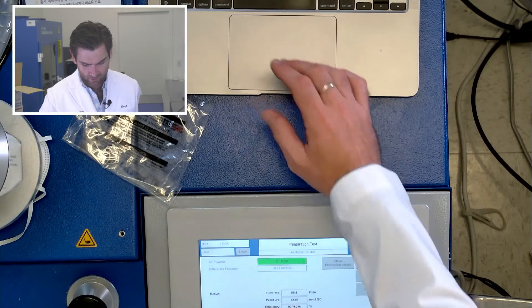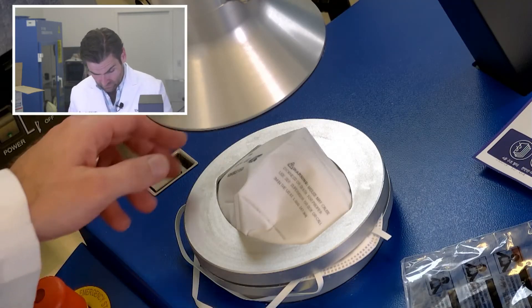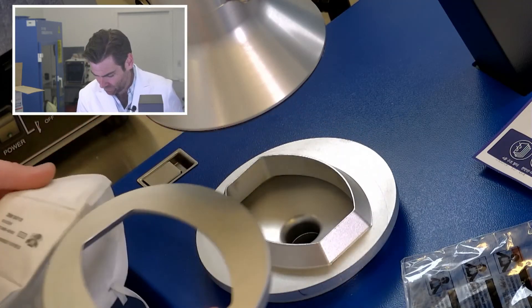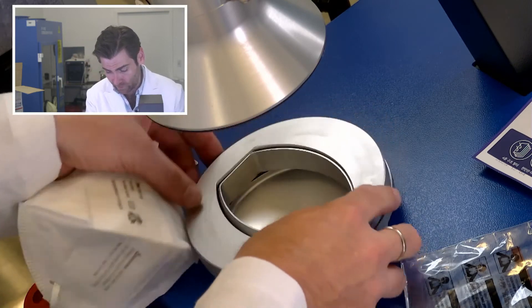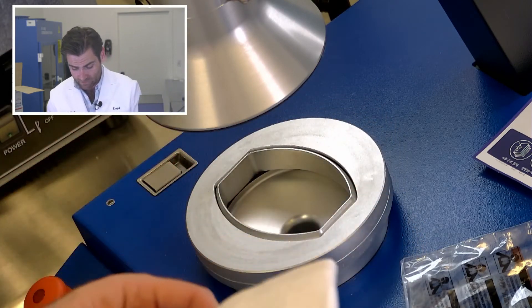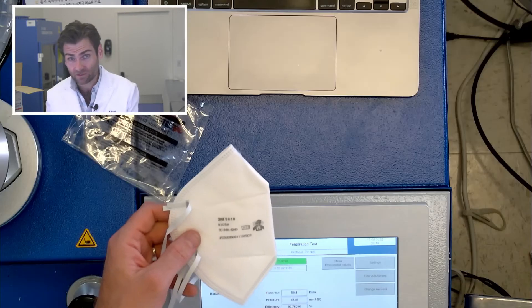All right, here we go. Survey says 99.75 with a breathability of 136.8. So 3M does not disappoint again.